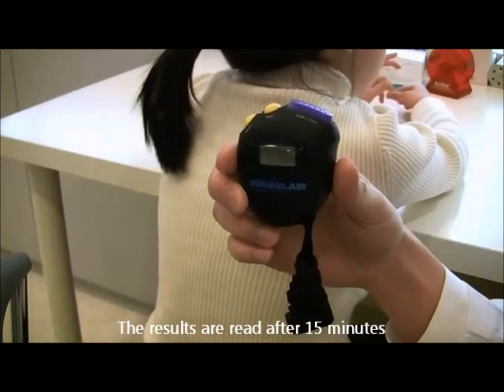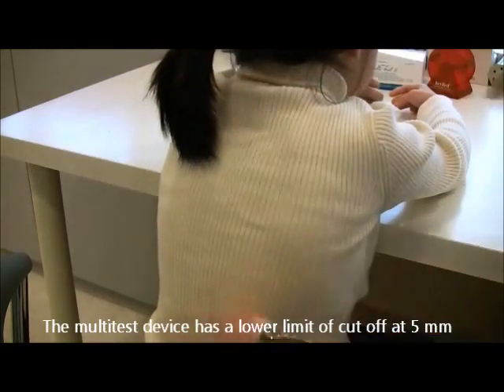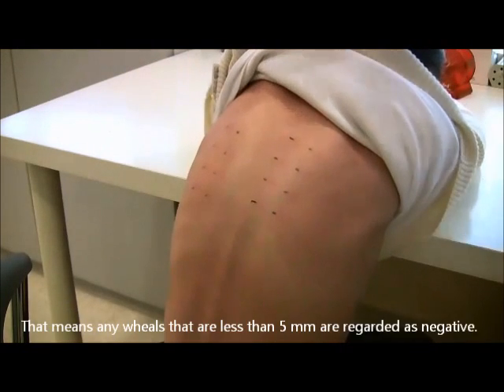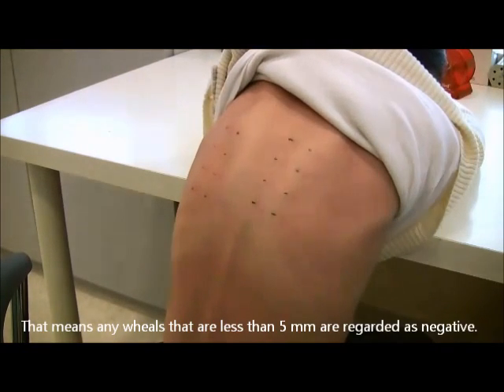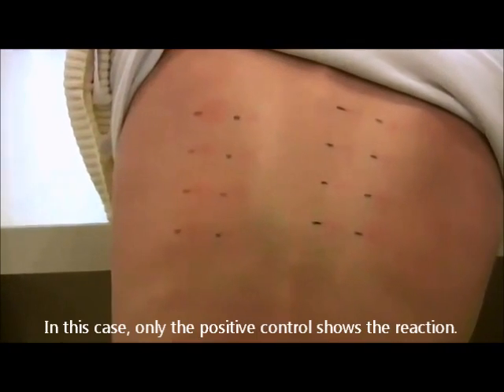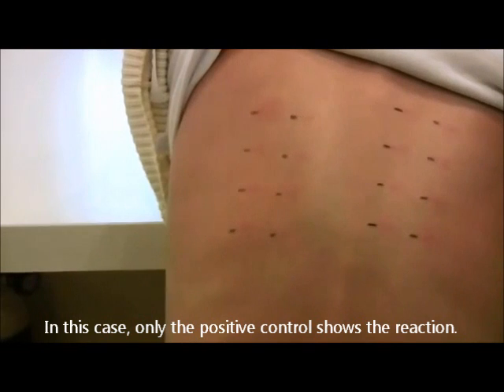The results are read after 15 minutes. The multi-test device has a lower limit cutoff at 5mm, meaning any wheal that is less than 5mm is regarded as negative. In this case, only the positive control showed a reaction.